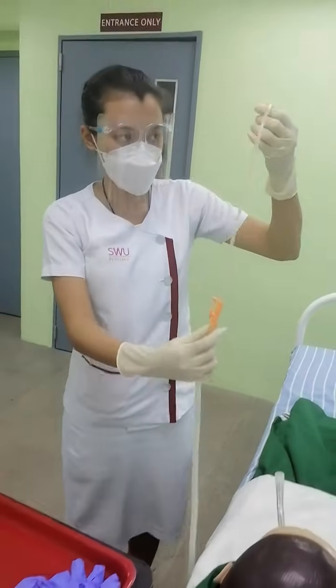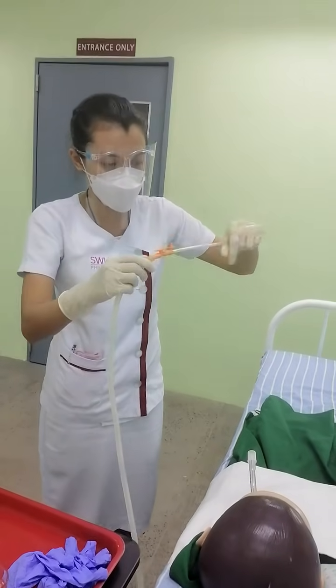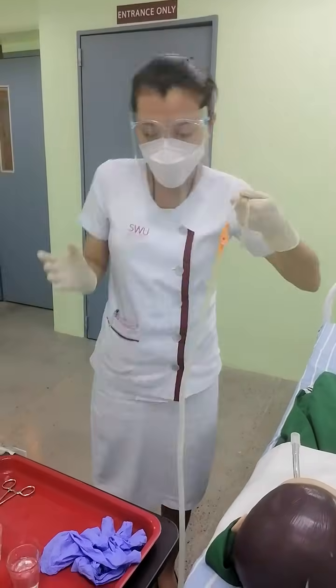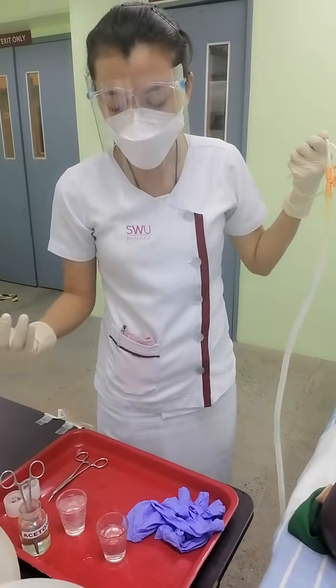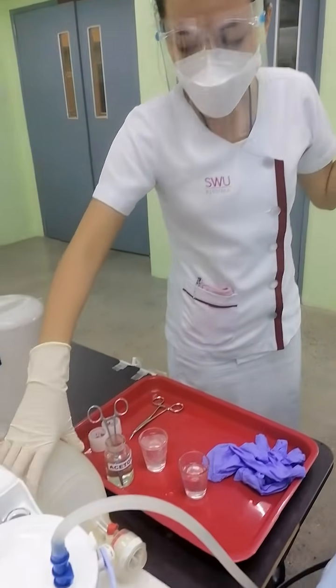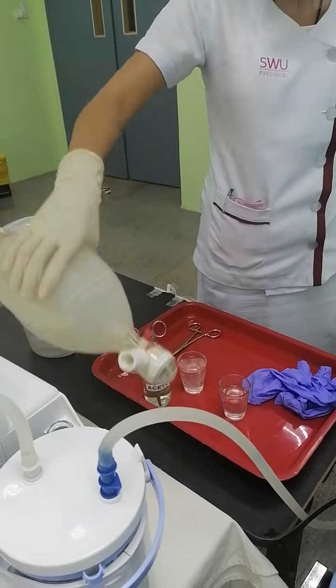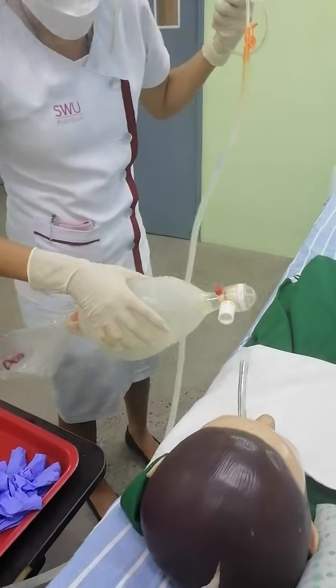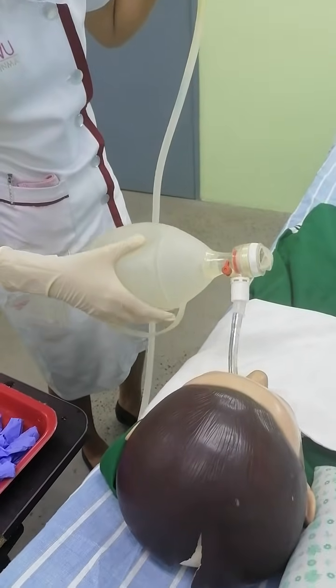After suctioning, I will coil the catheter again in order to prevent it from touching non-sterile areas. Then I will re-oxygenate the patient with the resuscitation bag using my non-dominant hand to pre-oxygenate the patient.